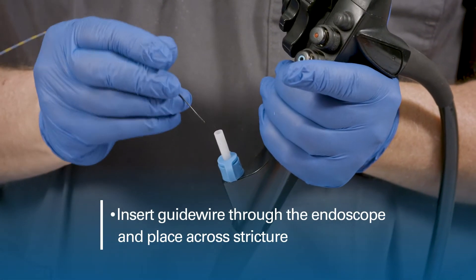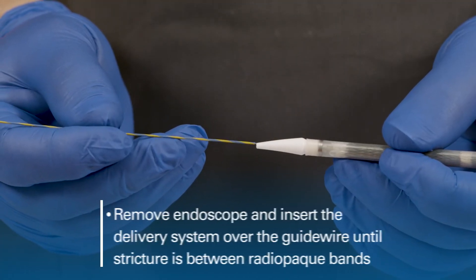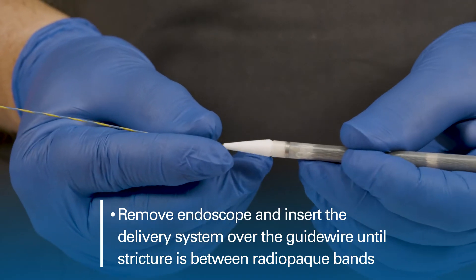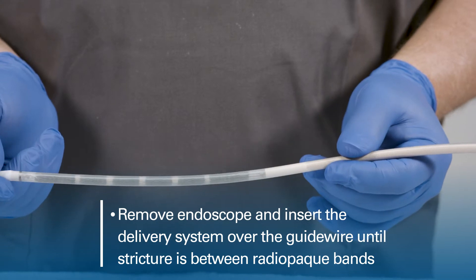Insert the guide wire through the endoscope and place across the stricture. Remove the endoscope and insert the delivery system over the guide wire until the stricture is located between the radiopaque bands.